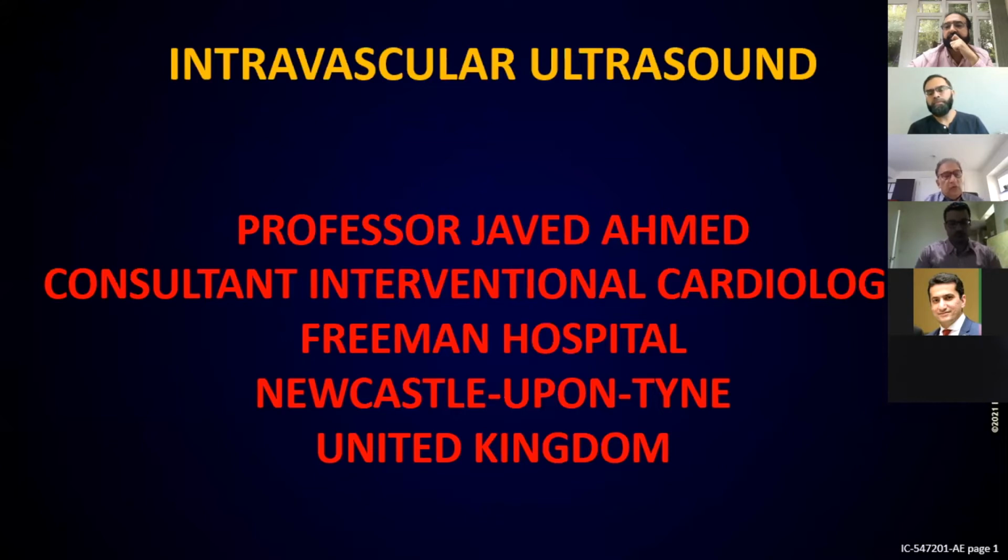The first is whether the lesion we are going to treat is significant and ischemia producing, and therefore should it be treated. And the second question is, has the PCI been optimized after you have decided to treat the lesion?